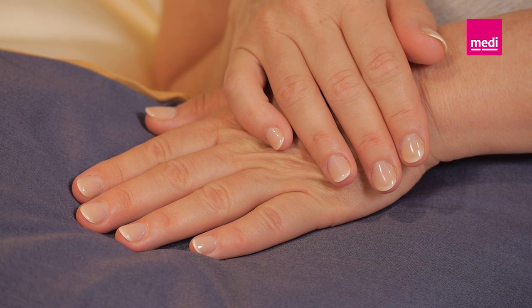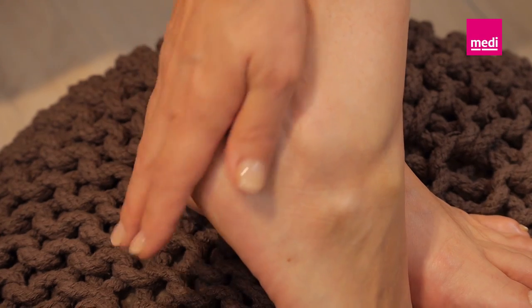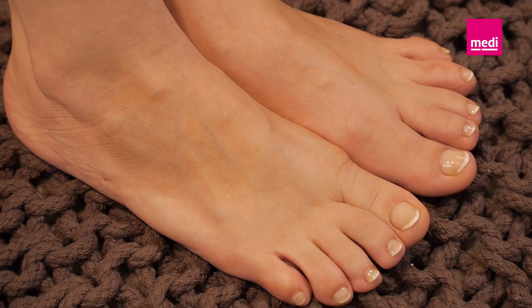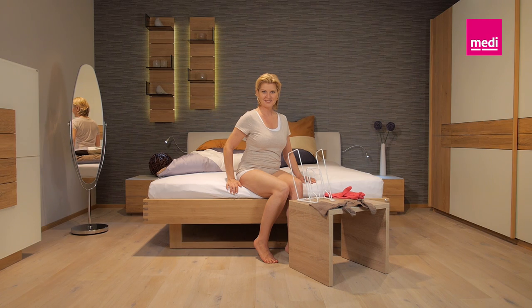Make sure you file your fingernails round and smooth before putting the stocking on. Pedicured heels and toenails are also important to prevent damage to the material. Please don't put on any jewelry or your wristwatch until you have put the stocking on.